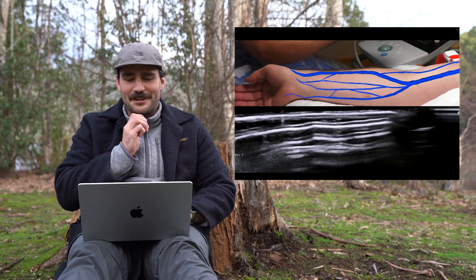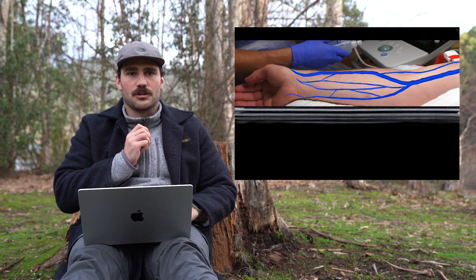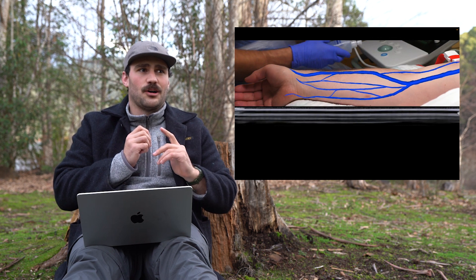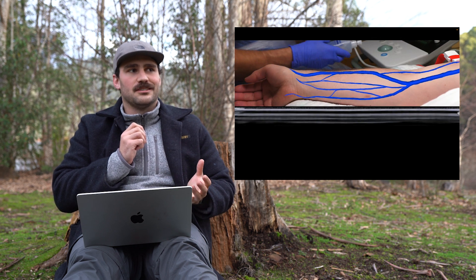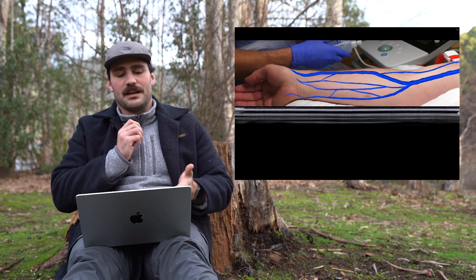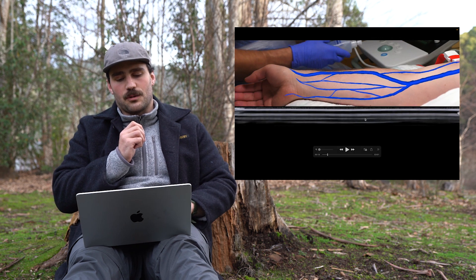This actually doesn't happen in real life, but really when I'm thinking about approaching cannulation — every time I look at someone's arm, I'm just thinking: what can I see and what can I feel? Often it's what you can feel that's more important. But when you've got the ultrasound, don't worry about what you can see and feel — that's out the window. You've probably already tried that. The ultrasound will tell you everything, so just get the gel on and stick the ultrasound on. Don't worry about any anatomy diagram.